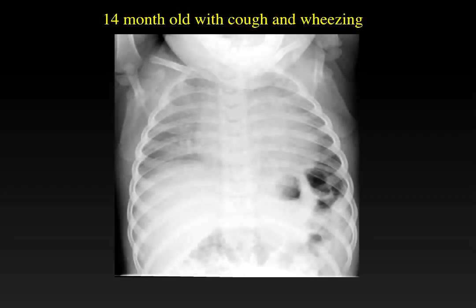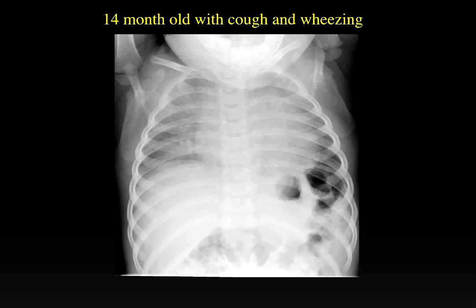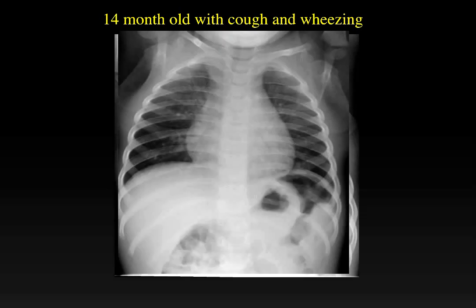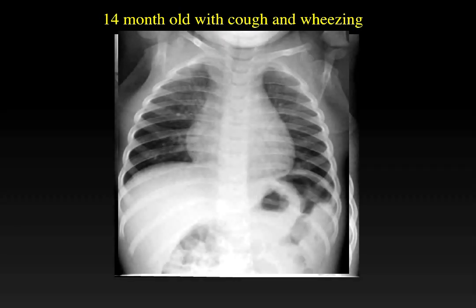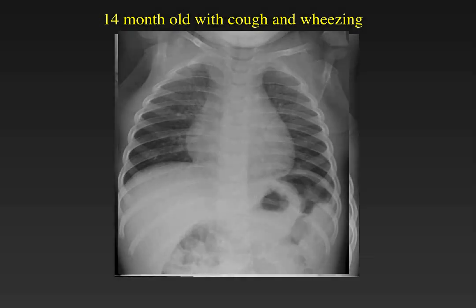Here is a 14-month-old who presents with cough and wheezing. On initial inspection, this chest X-ray looks like it represents a diffuse pneumonia with diffuse airspace disease. However, this is an underinflated chest. When we look at the number of posterior ribs within the inflated lung, we only count seven. Two minutes later, the chest X-ray was repeated, and we can see at now 10 ribs of inflation that this is a completely normal chest X-ray. A common pitfall in interpreting children's X-rays is calling a hypoinflated chest a pneumonia.